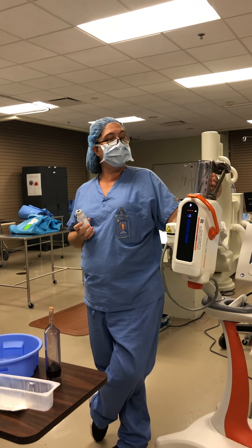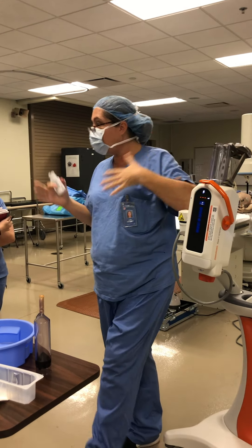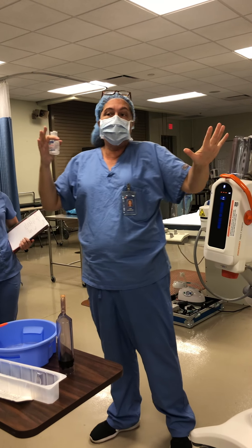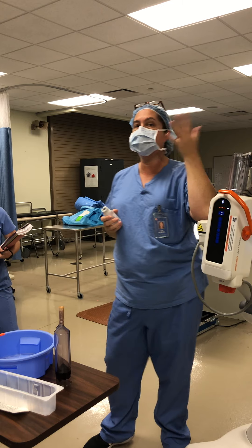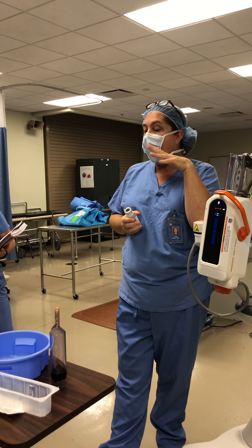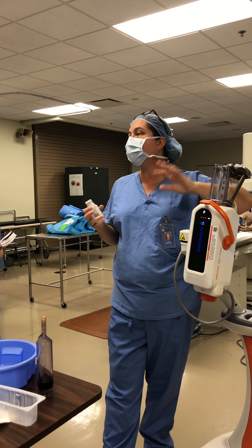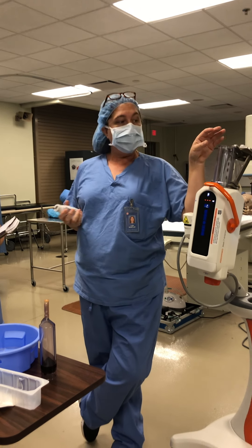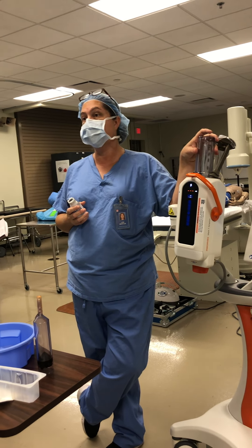Once you do load it in here — a lot of times we're loading this as the process of getting your room ready — you don't load it just right before you're going to do the injection. It could sit in there 10, 15, 20 minutes, and it might actually warm it up a little bit. Some of the warmers on older machines don't work, but if you have a place with newer ones, most likely the warmer does work.